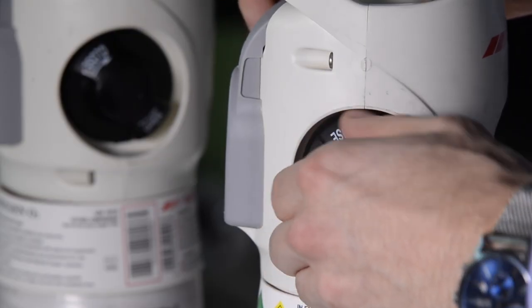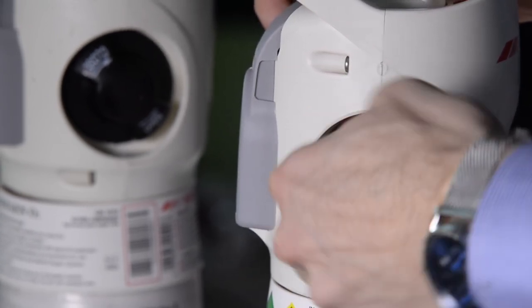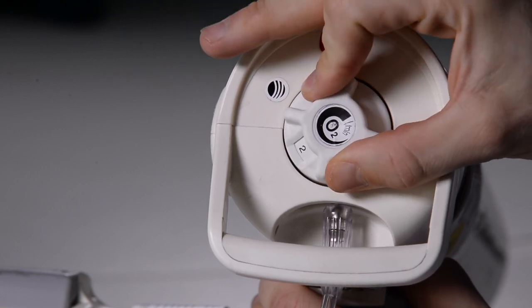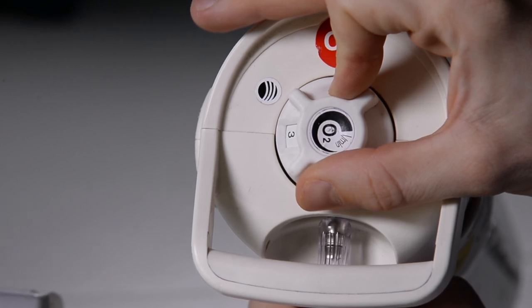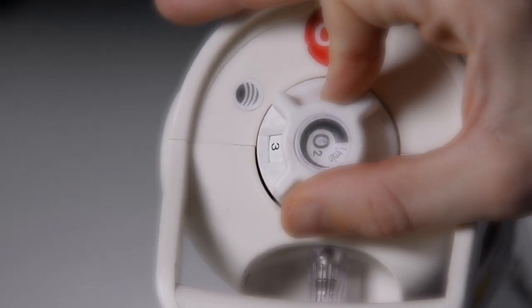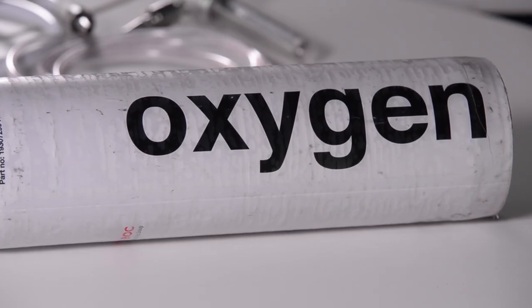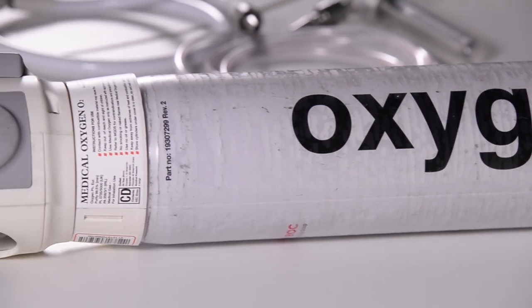Slowly turn on the cylinder by rotating the hand wheel anti-clockwise until it comes to a complete stop. Set the prescribed flow by rotating the dial flow selector, ensuring that the correct flow rate number is clearly visible in the flow selector window. Check the gas is flowing. Ensure the cylinder is turned on and leak tested before placing near a patient.